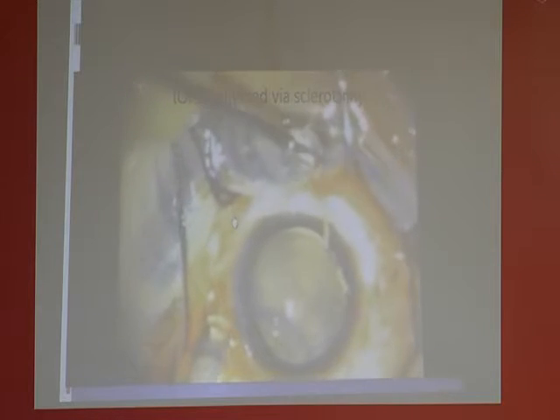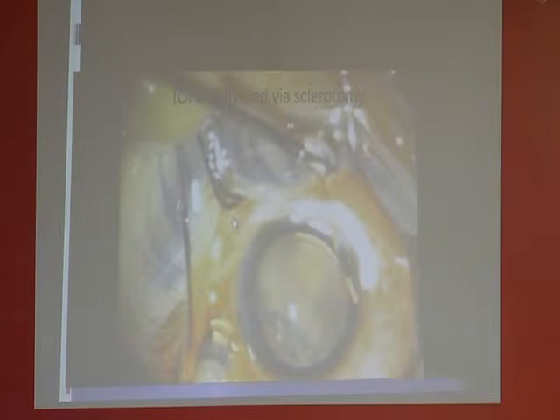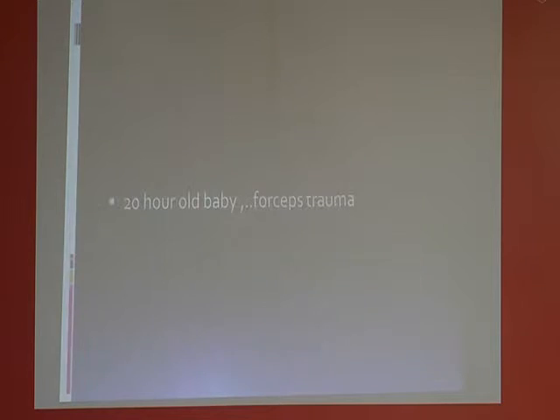So we first dislodged it from the retinal side gently with a cutter, but it was very difficult to bring it out through the sclerotomy. It will not come out through the sclerotomy, because the moment you try to bring it out, it will either touch the lens and you have to sacrifice the lens. So what you do is, you go with the chandelier light, go through instruments and straighten the foreign body inside the eye and bring it out through the sclerotomy intact, not damaging the lens.